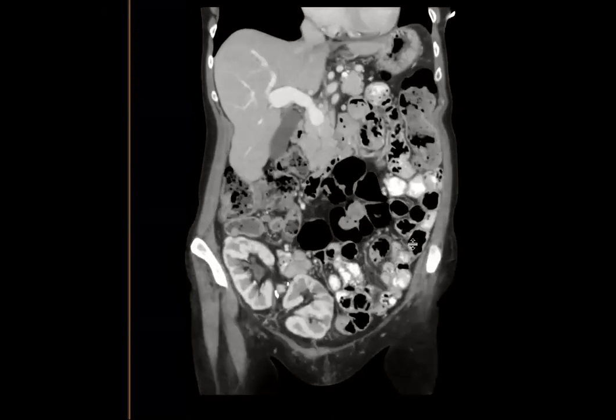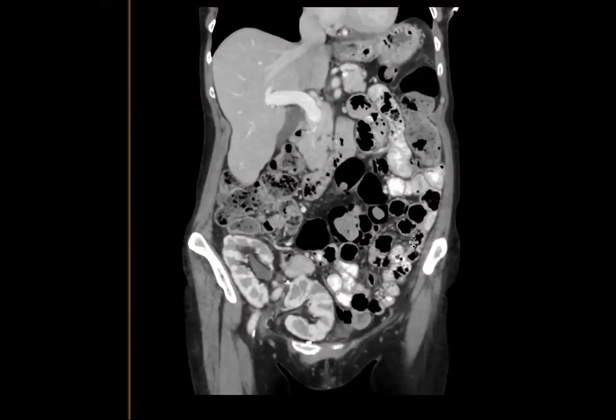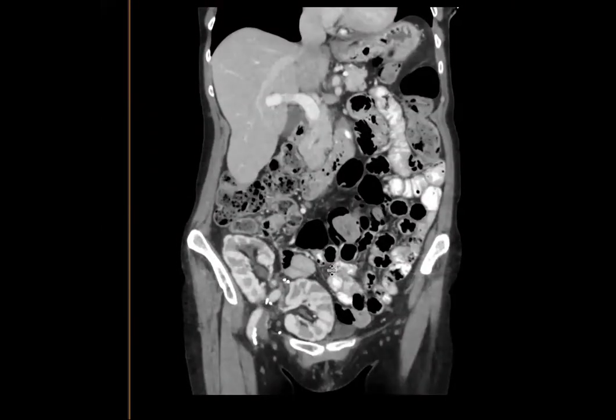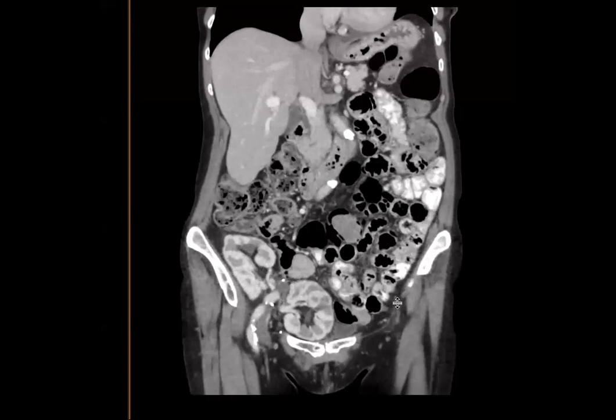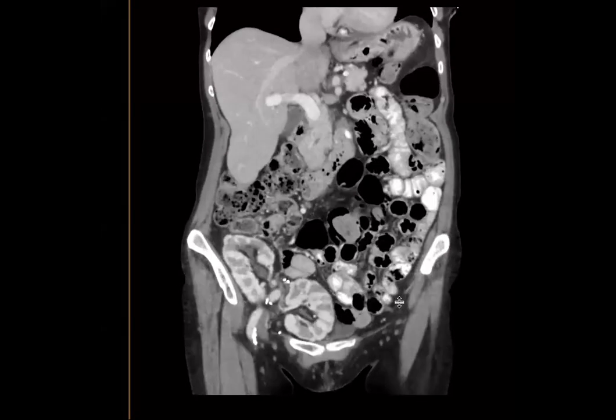And I have a case where I had three kidneys. But like you said, this is not a case of supernumerary kidneys, I think. Anu, you can correct me if I'm wrong. But you also said it's not normal to transplant two kidneys. But there is a situation in which you will get two kidneys transplanted. Yes, and that is the point of showing this case precisely.